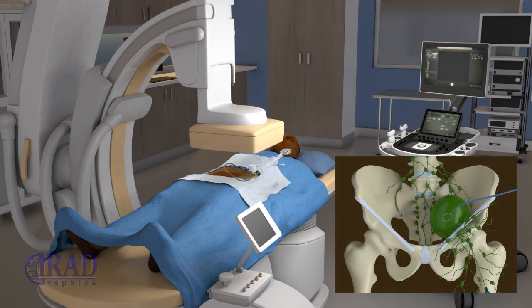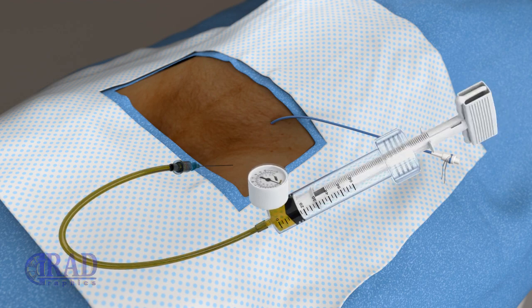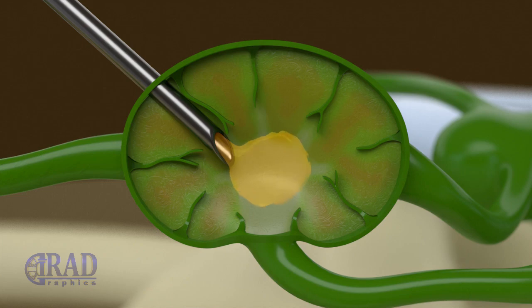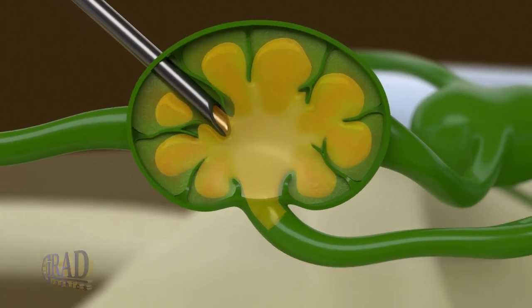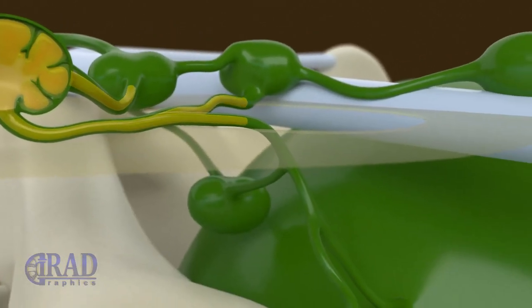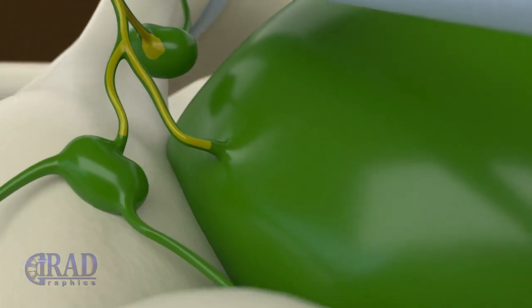Under fluoroscopy guidance, the contrast is injected through the needle into the accessed lymph node, which not only opacifies the lymph nodes along the track and lymph vessels, but also slowly reveals the lymph leak into the lymphocele.